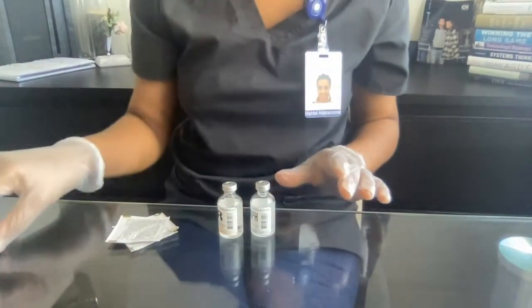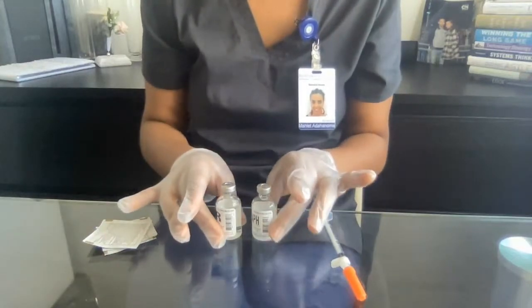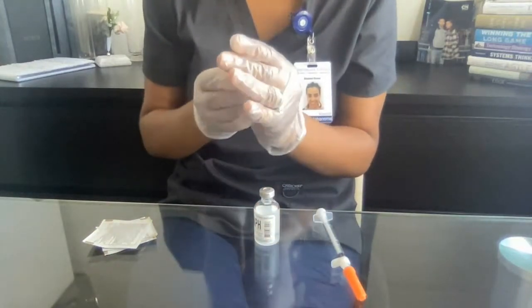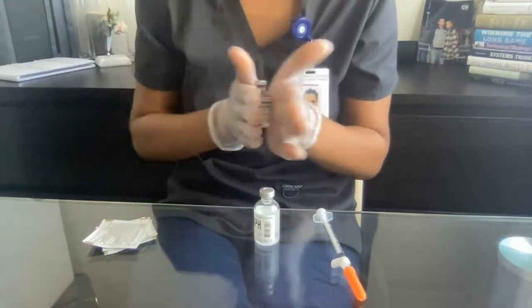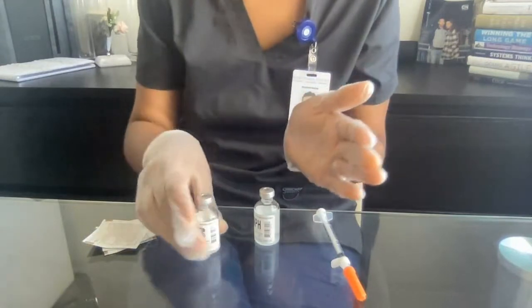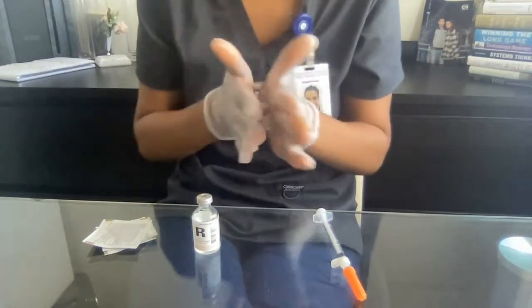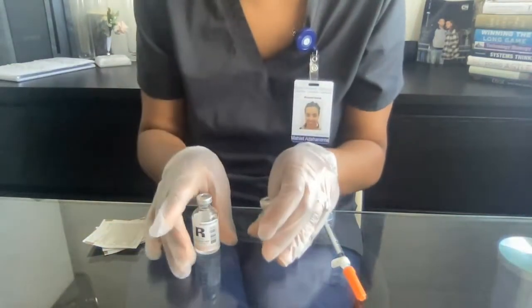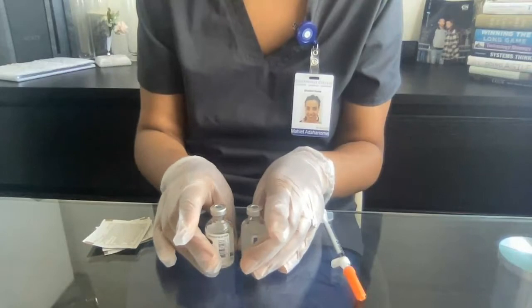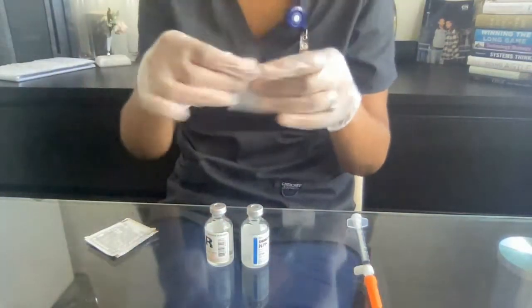Okay, I have my alcohol swab and I have my needle here. The first thing I'm going to do is roll the vials between my hands and make sure they're mixed thoroughly. I'll pick it up, put it between my hands, and roll until they're thoroughly mixed. Do not shake it.